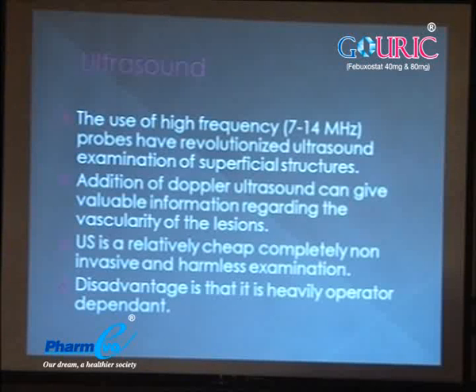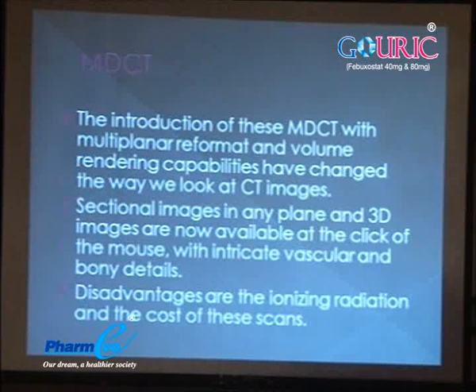Ultrasound examination of superficial structures. And of course, the addition of Doppler ultrasound can give valuable information regarding the vascularity of the lesions. Ultrasound is a relatively cheap and completely non-invasive method and harmless examination. The only disadvantage is that it is heavily operator dependent.